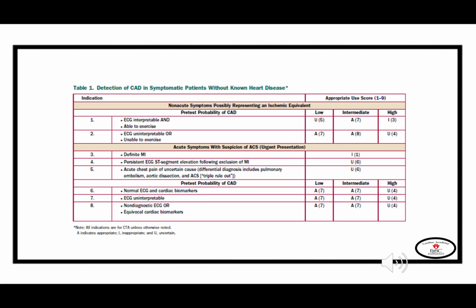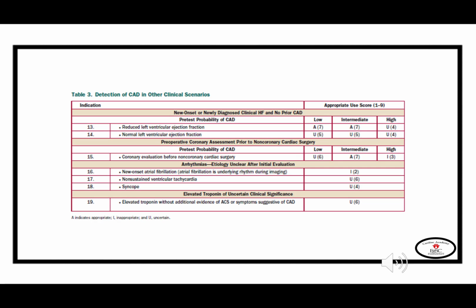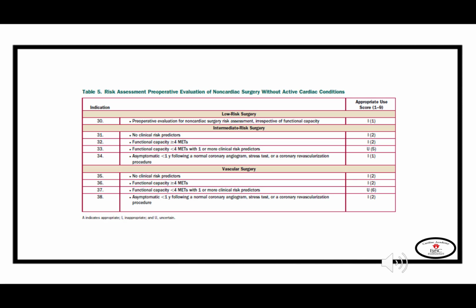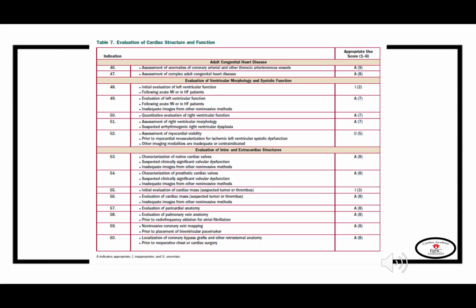and they covered different indications for the coronary or the cardiac CT, ranging from detection of coronary artery disease and using coronary CT angio in different clinical scenarios, even sometimes with new onset heart failure or detection of arrhythmias with unknown cause, and the presence of prior testing techniques, preoperative evaluation of patients for non-cardiac surgery, risk assessment post-revascularization, whether following PCI or CABG, and in congenital heart disease and evaluation of intra and extracardiac structures.